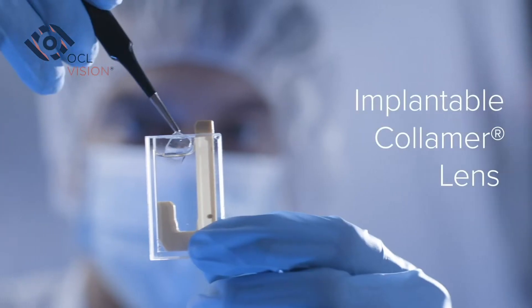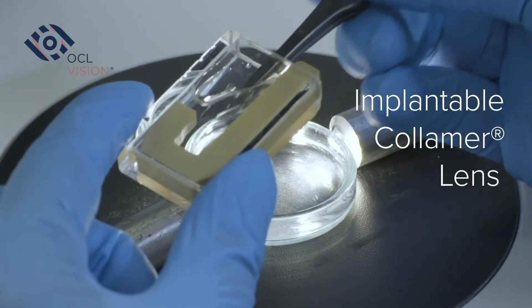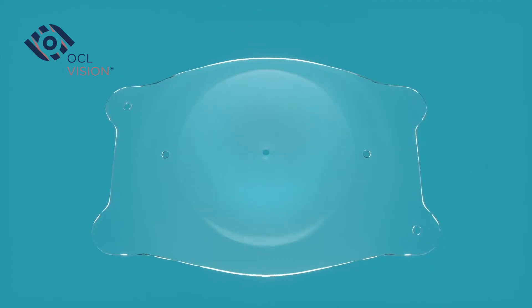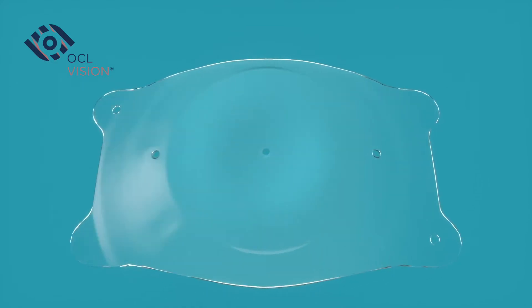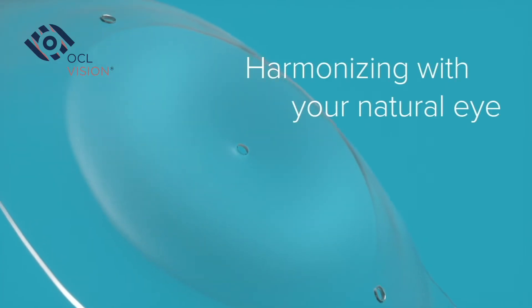EvoVision ICL is an implantable collamer lens that can correct common visual limitations like nearsightedness and astigmatism, freeing you from glasses and contacts while harmonizing with your natural eye.